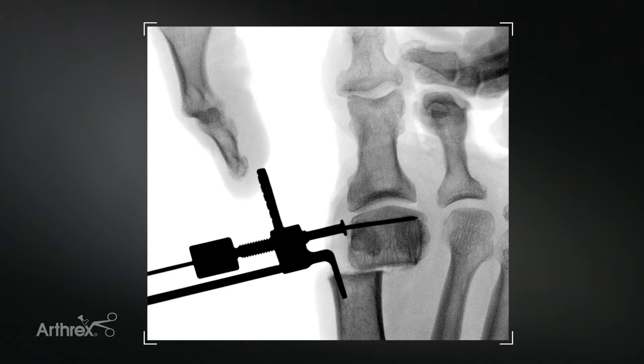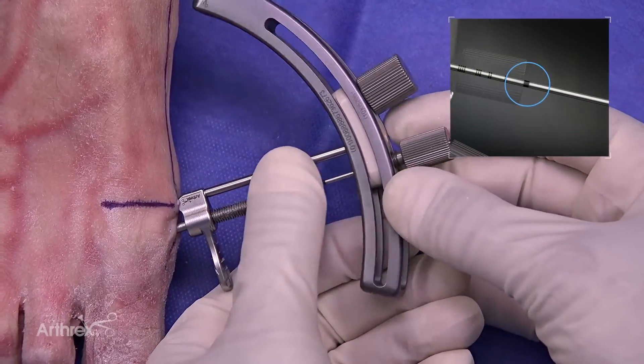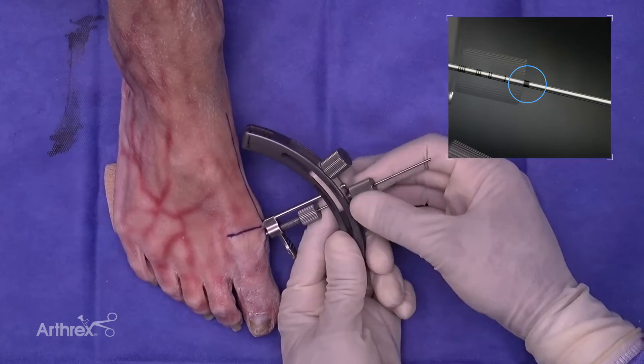However, in cases of larger IM angles, it's not abnormal to see upwards of 75 to 90 plus percent translation. At this stage, the arc of the guide is placed over the guide wire to the appropriate laser line and then tightened.